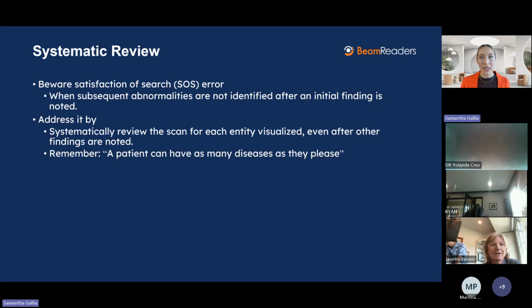So this would be, for example, a patient comes in, they're having pain on a tooth, you identify some findings that you think might be a vertical root fracture. And so you take a CBCT, you see a vertical root fracture on the tooth, and you're like, yes, I got it, nailed it. However, there might be another lesion on the other side of the mouth that you also captured in that image that you didn't quite catch because you thought you found the thing causing the pain.